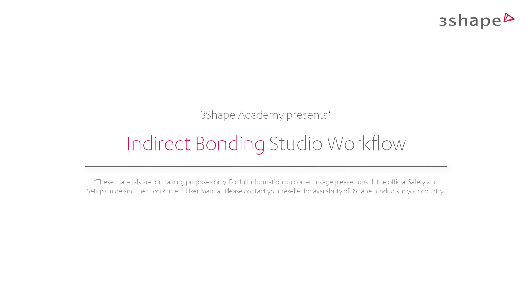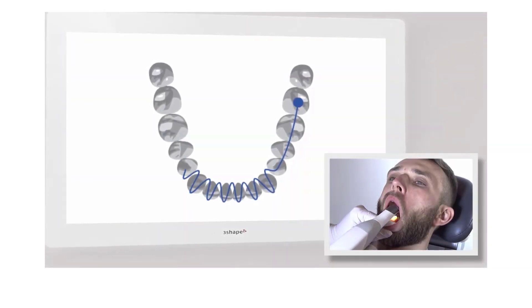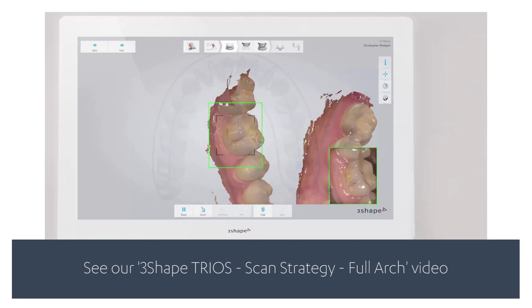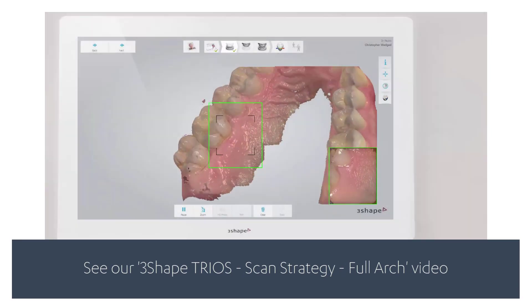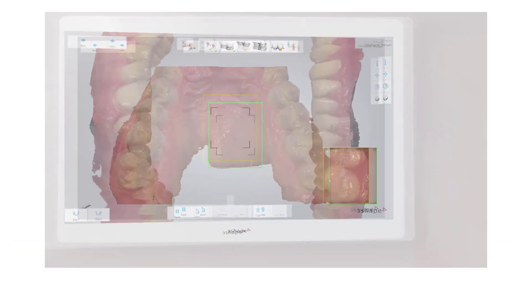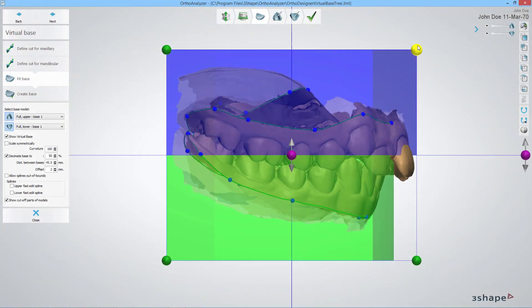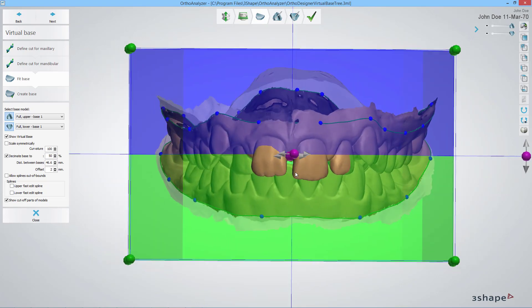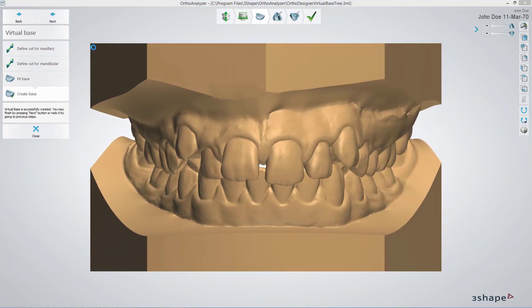In this video you will learn how to use the bracket placement workflow so you can place brackets for digital indirect bonding. To start bracket placement, you'll need a scan of both arches and a bite scan of a patient. It is worth knowing that it can be beneficial to put a virtual base on the scan before continuing with indirect bonding, but it isn't required.